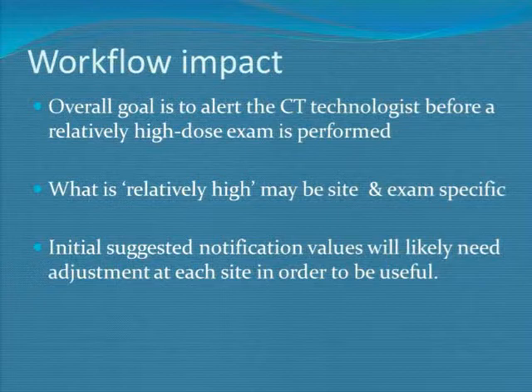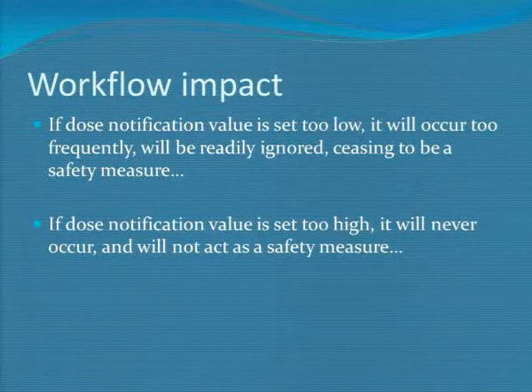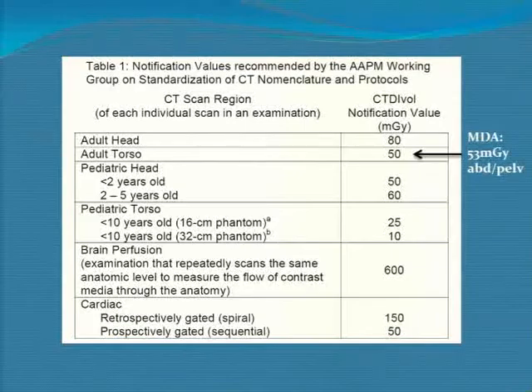Don't be surprised if whatever you pick to start out with needs to be adjusted. I totally expect that to happen. And you have to be careful with this notification value. It's kind of the porridge being too hot or too cold or just right. If it's too low, it will happen all the time, like every other exam, and people will expect to see it, and they won't take it seriously, and pretty soon it'll be totally ignored. So there's no safety there. If it's too high, it will never trip, and that's really not giving you much safety either. So there's sort of a good sweet spot that we're all going to probably have to find for some of these exams.